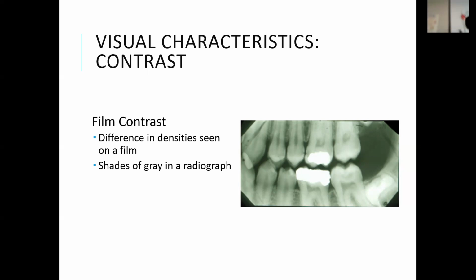Oh, like why it's faster? I think it has everything to do with the emulsion, which we will talk about, the actual makeup of a traditional film, in another class. There's a chemical, they call it an emulsion, and it's laid over this plastic film. That emulsion reacts with the fixer and the developer.